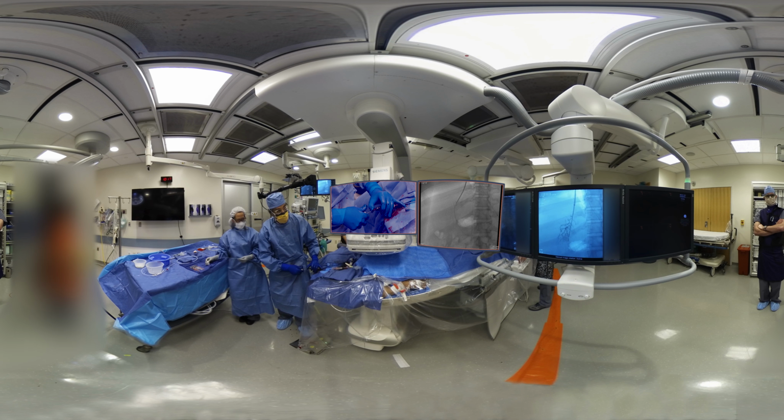At this point, we've got the wire in the splenic vein. We're not going to advance it off camera because there's a risk of injuring the delicate splenic pulp. So we'll keep it in view. And now we're going to mag up again.